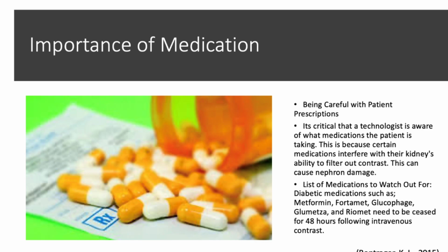So you want to inform the patient that you want to check their prescriptions, make sure there's no diabetic medications, because they interact with how the kidney functions, and you can have some serious nephron damage if we do not instruct the patient to avoid taking diabetic medications for 48 hours following the contrast procedure. So we're going to check that. We're going to make sure that everything is fine, that the doctor hasn't ordered any pre-medications or anything like that, but that's for a different slide.